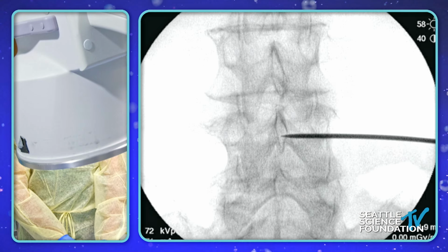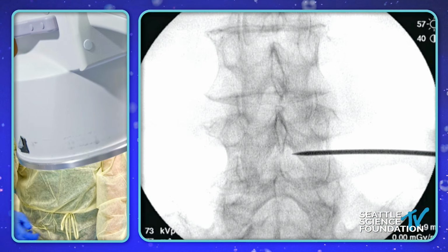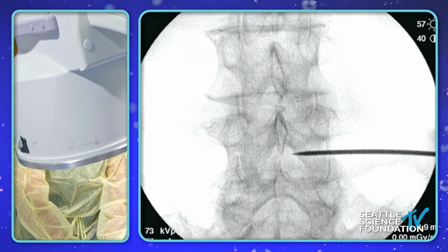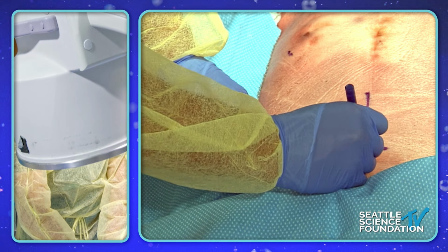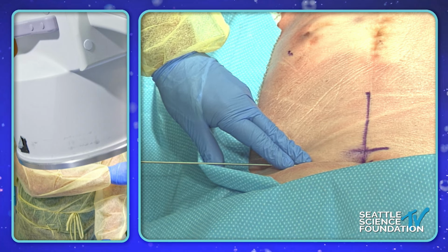Okay, so that window's bigger now, so I'm gonna take this one now. And shot there. Right there, shot. So I'm gonna mark that. I like that edge right there. So I'm gonna mark this here. Okay, knife. So while he makes that incision, can we quickly switch back over to the presentation?